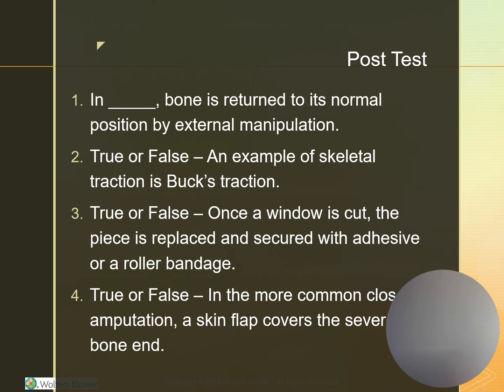When they're getting up from a chair with crutches or with a walker, they always want to hold the crutches in one hand or hold on to the walker with one hand, reach back for the chair, and then lower themselves down. And then they would get up just the opposite.